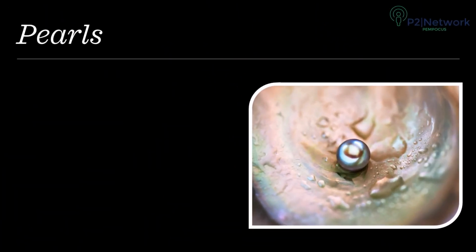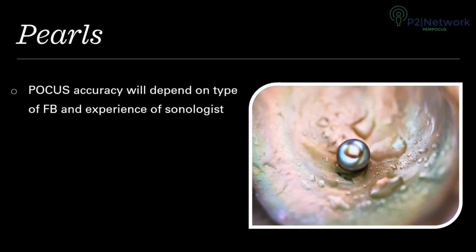So, reviewing some pearls and pitfalls. Accuracy is often based on the type of foreign body. POCUS by experienced emergency medicine physicians for detecting gravel, glass, plastic, wood, and metal has a sensitivity of approximately 96%.